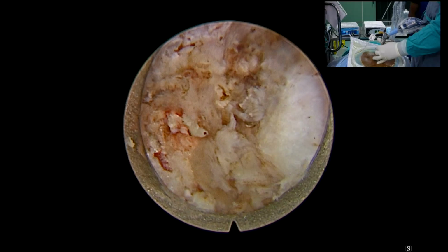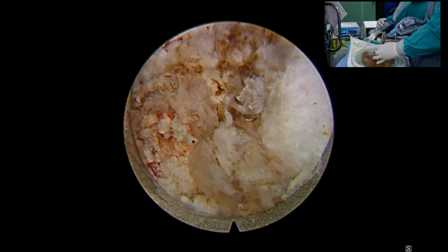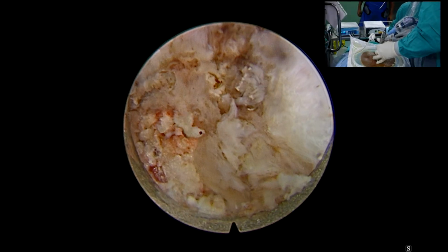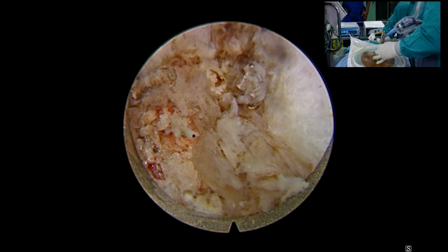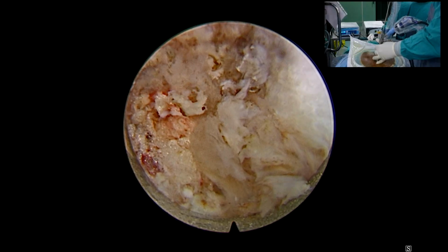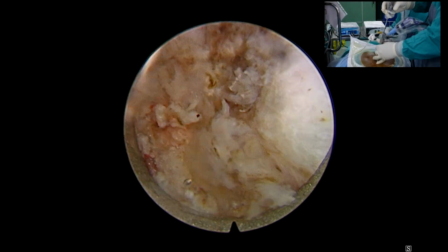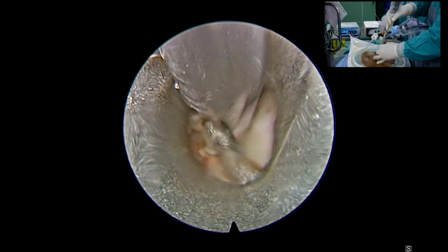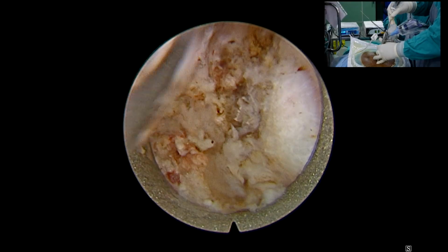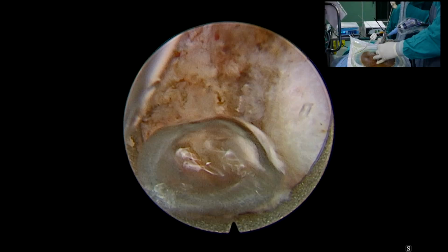Which drill are we using? We are using a cutting side protected burr with a mechatronic shaver system. Jishan's shaver system provided by Eagle Medical System by Mr. Karan.